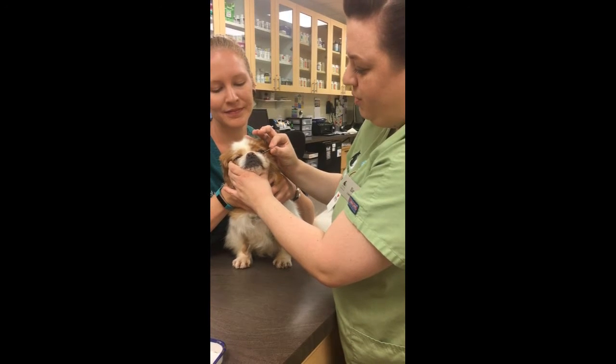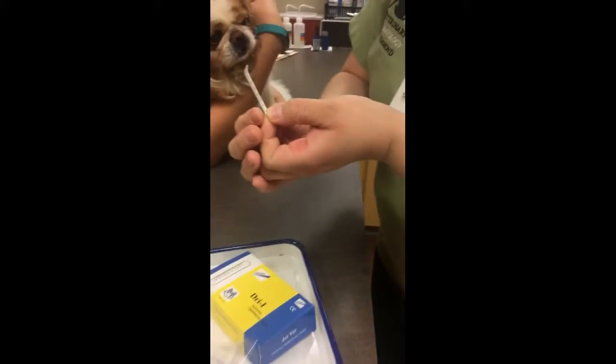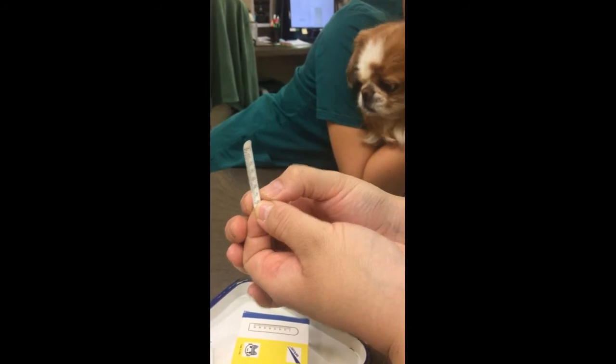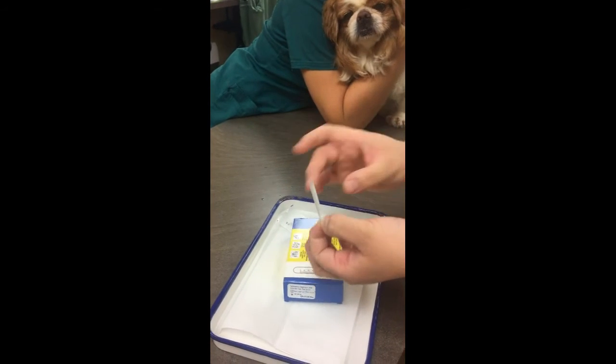All right, we're going to gently remove that. Good boy. And then we're going to read our results on here, which looks like it's right at the 28 millimeter line, which is normal.